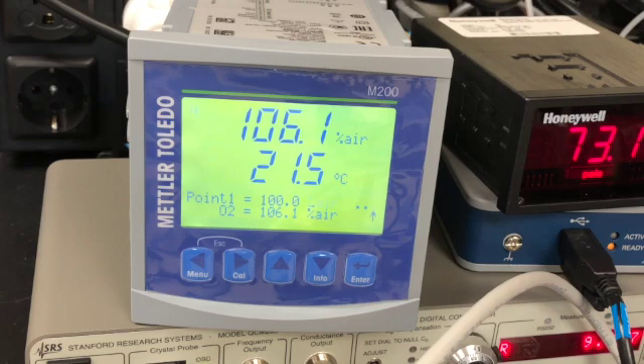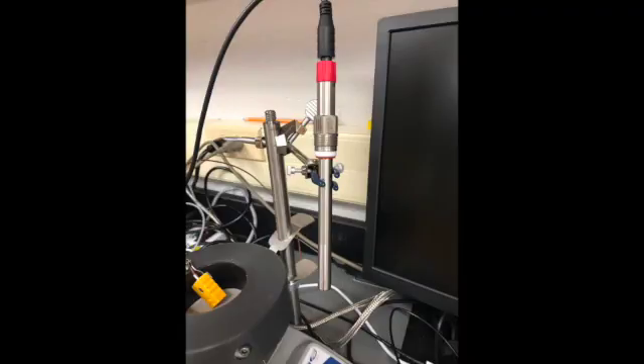Now we wait for the oxygen sensor to stabilize. The oxygen sensor is sitting vertically in its clamp — in this way we are calibrating at 100 percent air.